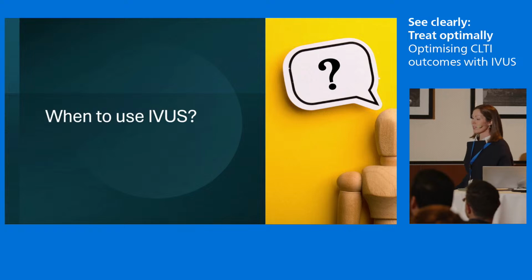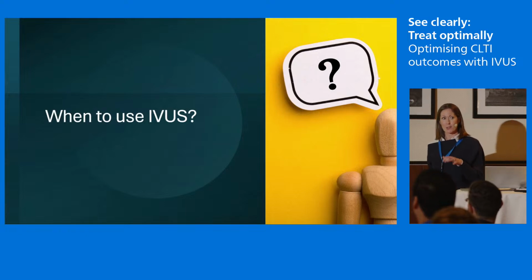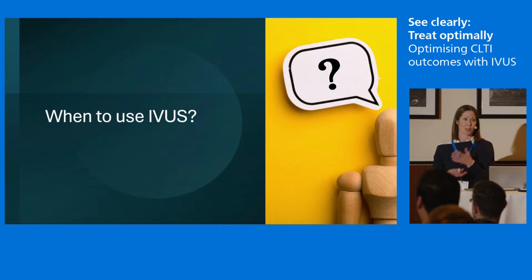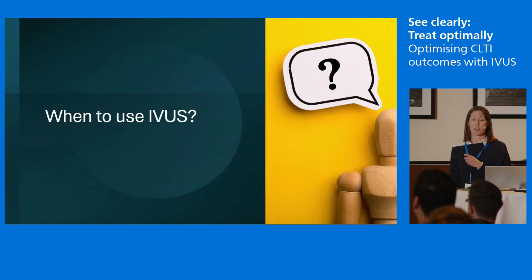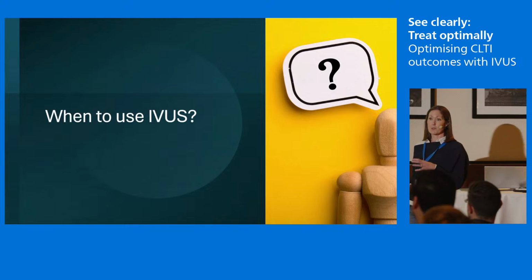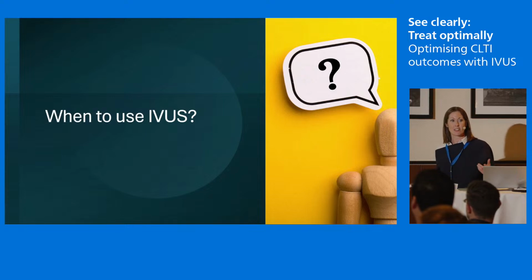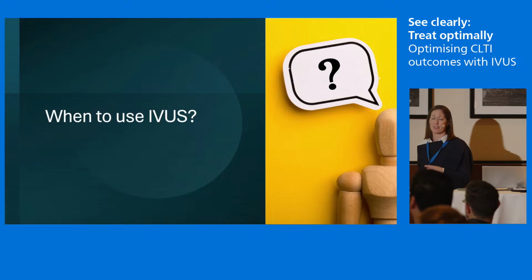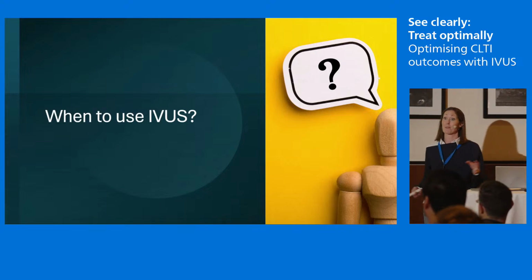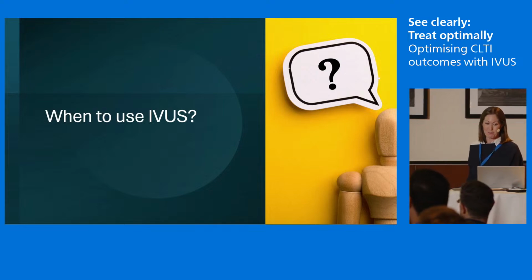So I've heard people talk about lots of different applications, and I'm aware that most people in the room are really experienced operators in the aortoiliac segment, in the venous segment, and in the CLTI segment. For me personally, I found it the most useful in the SFA POP segment. That is because, one, I find it the most challenging to treat, and two, there's the biggest range of treatment devices. So it helps me to work out my ideal treatment algorithm for that patient. And of course, I also have the benefit of working with Ash and NT pretty much every Friday. So I have a masterclass every week in algorithms for using IVUS and CLTI treatment.